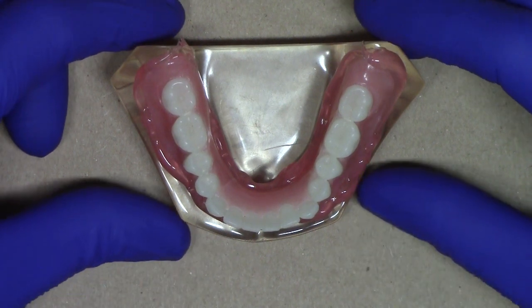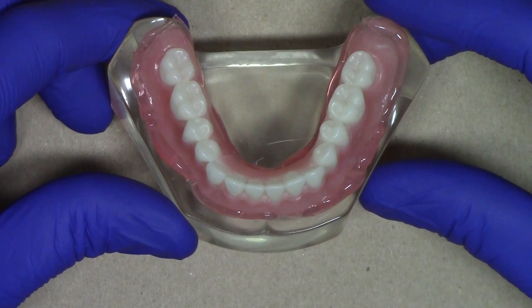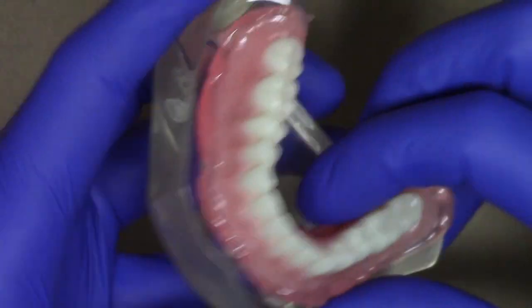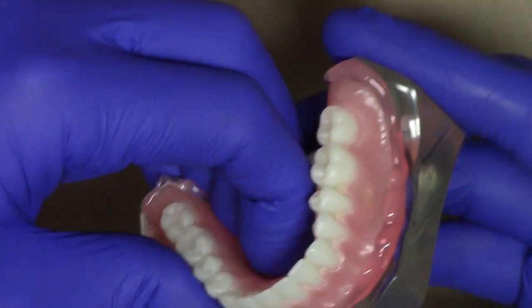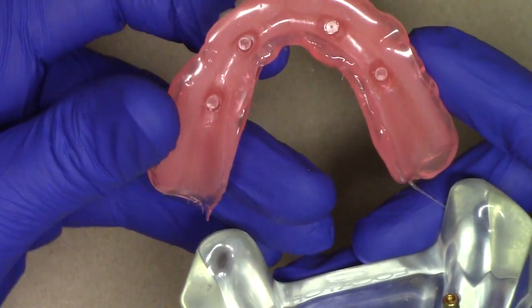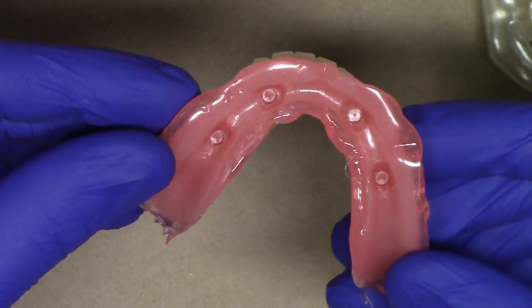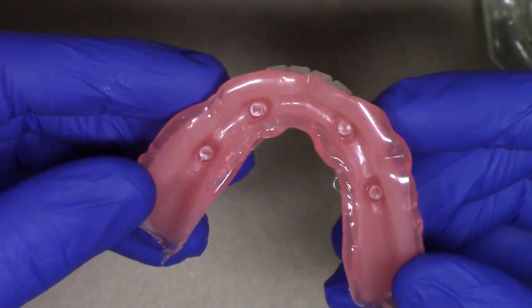After approximately 5 minutes, the CHAIRSIDE Soft Reline Material has had a chance to fully set up. I'm going to go ahead and very carefully tease this denture apart, and sometimes it can be a little bit strong. In the mouth, you're going to have a lot of saliva that won't necessarily cause it to be this retentive, at least in the mouth. There we go, very nice and carefully out. Beautiful. As we see here, we've sufficiently captured all of the locator abutments in place, and also we have nice coverage pretty much everywhere on the complete denture.